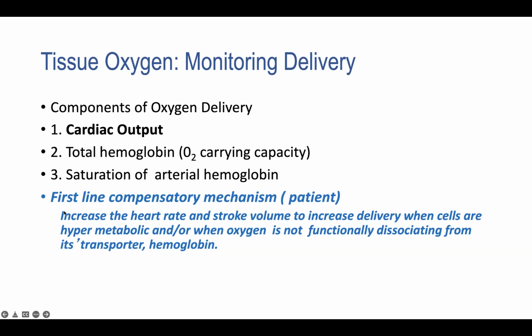Now, if you're standing idly by, let's just say that for 5 hours last night, you were monitoring SvO2 and charting that it was 55, 56, 58%, that's below 60. And your patient had metabolic acidosis heralded by a base deficit of -5, -6, -4, and you did nothing.